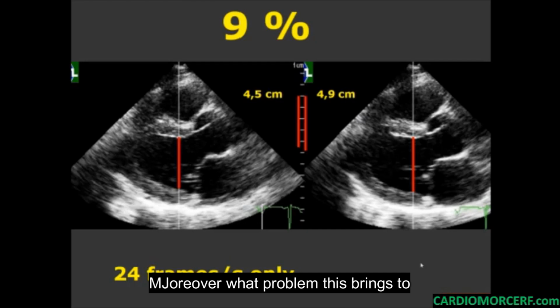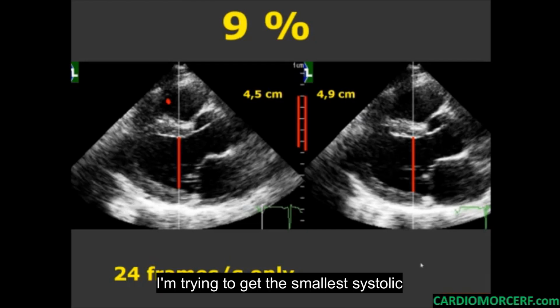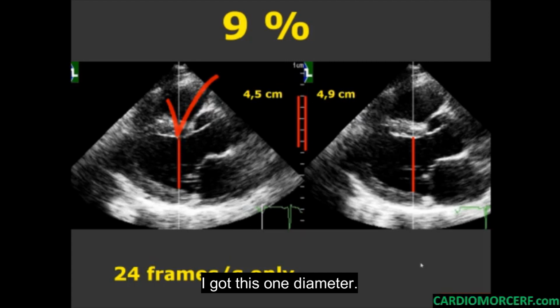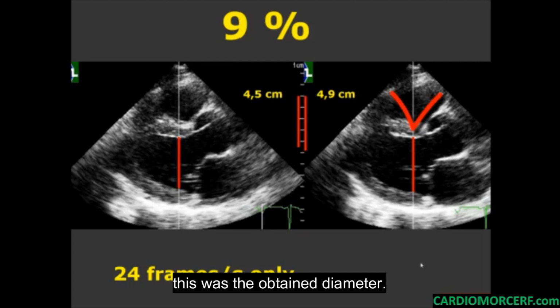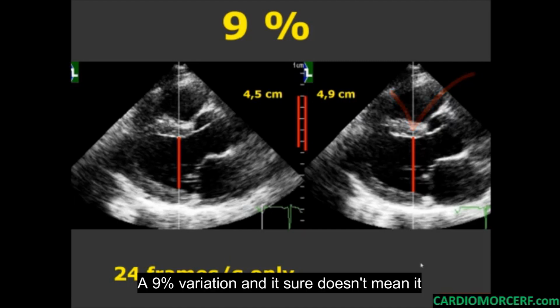Moreover, what problem does this bring to measurements? See here, I'm trying to get the smallest systolic diameter and going frame by frame. I got this diameter, and at the next frame, at the same time within the cycle, this was the obtained diameter. A 9% variation, and it sure doesn't mean it may not be larger 3 or 4 frames later.